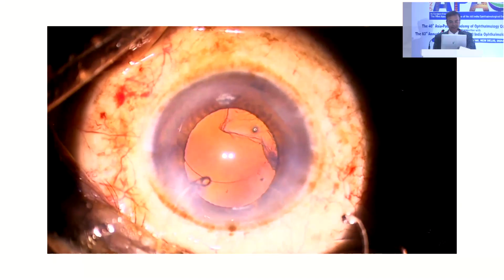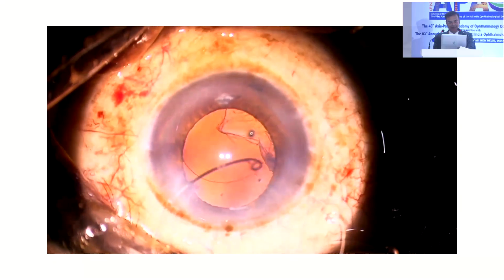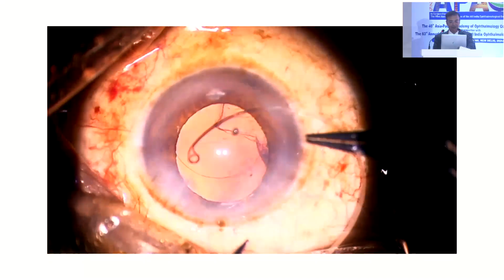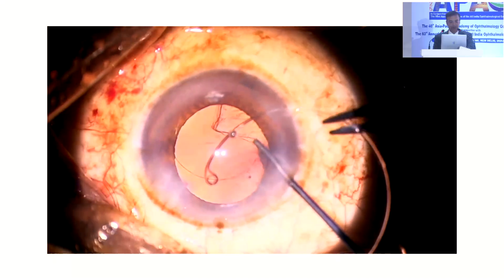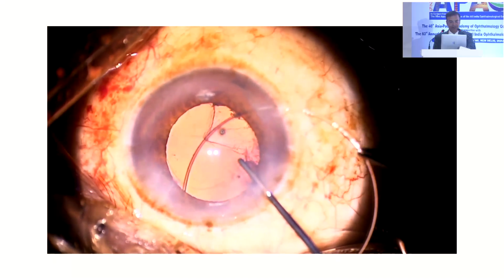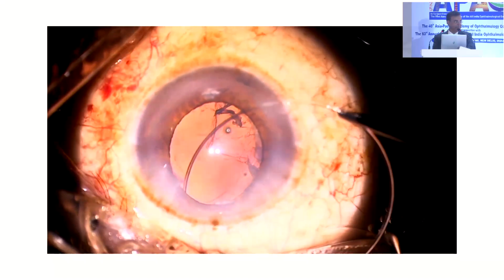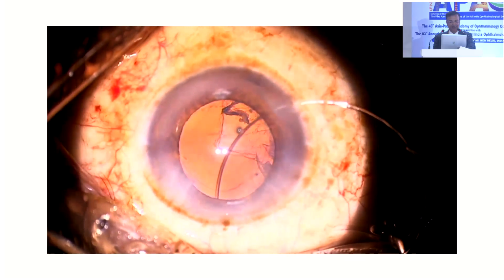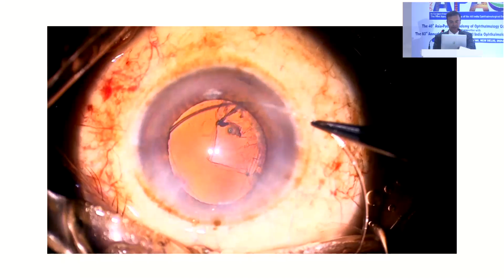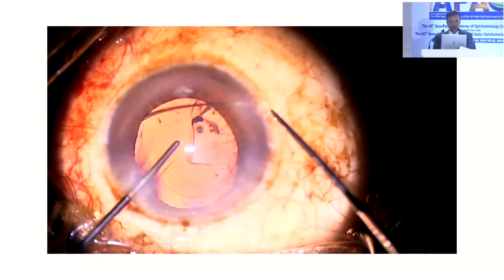But I don't want to give up. I want to see if I can still put in the CTR. So I'm trying another direction. That doesn't work either because it's not entering the bag. The bag is now a little behind. So I'm going from the other side port now, and I'm going to do a guided kind of a thing. And this time I'm going to pick up that injector that you showed. So it seems to be behaving so far. And so I got lucky, 4th time.